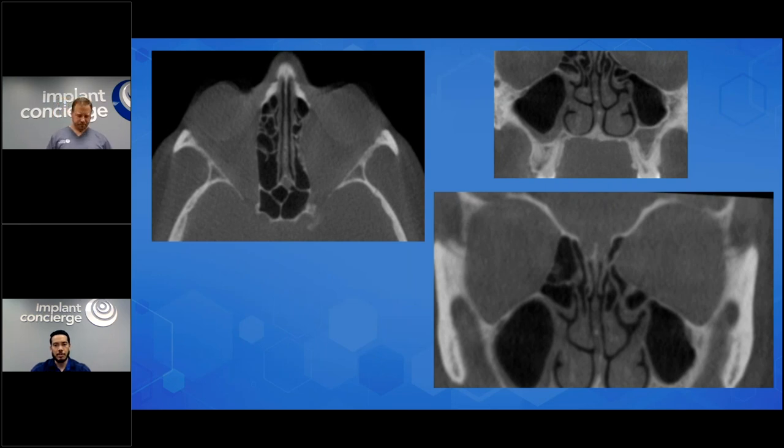Yeah, and I'll comment on that from the guided surgery side as well. At least with current CBCT technology, it's not really an exact value that you can make a basis off of. It's really more comparative. So the Hounsfield unit is useful if you're trying to compare the density of one area versus another. But to say, look at this bone, if it falls within this range, that's great for implant stability and integration, it's just not there yet, at least with today's CBCT.